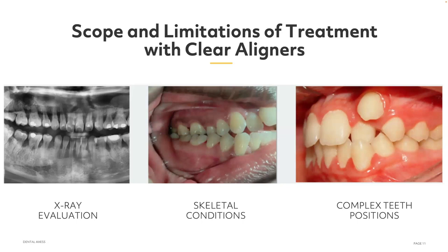This includes any therapy that you want to use for your patient. At the end, you're going to move the teeth. So to move them, we need to have good criteria to have a good result. If we don't have a good bone condition or good periodontal ligament condition, or there are short roots, at the end we can make this issue even bigger if we try to move the teeth and don't have the correct criteria. Then we have the skeletal condition.